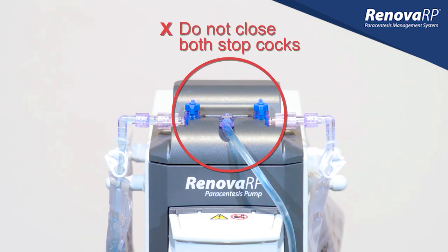One of the most important things to remember when using the Renova pump is to never close both of the blue stopcocks at the same time. Doing so can cause pressure to build up and put stress on the tubing, increasing the risk of fluid exposure.